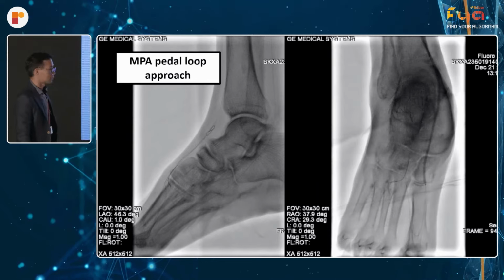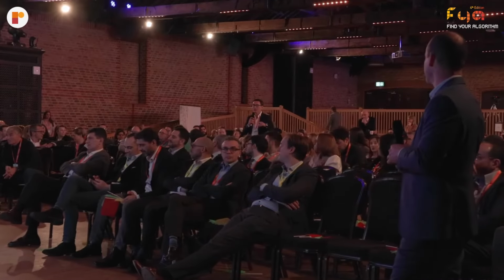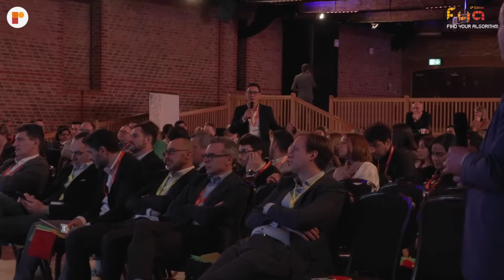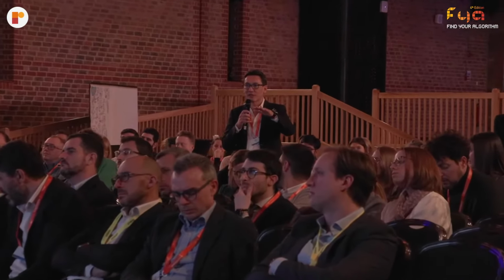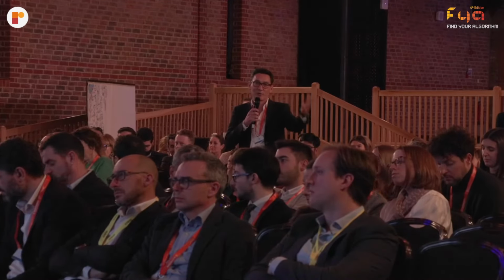So don't forget, if you really need to, use the medial plantar artery approach. Let me underline a really important fact, because we have seen this flat panel moving all around. We usually see people doing all of the BTK, BTA work in a really static position, and it's really important to keep on moving, to keep a clear idea where your wire is and where you're aiming to go. So just keep on moving your C-arm or your flat panel.